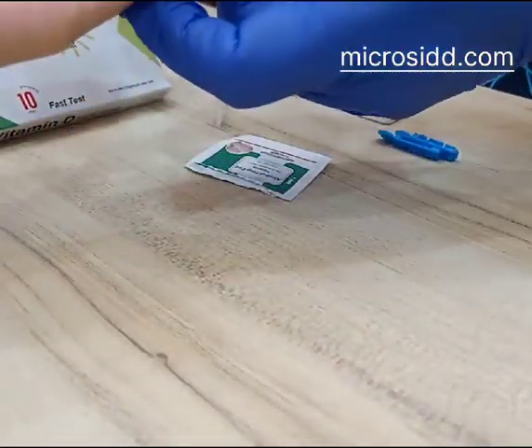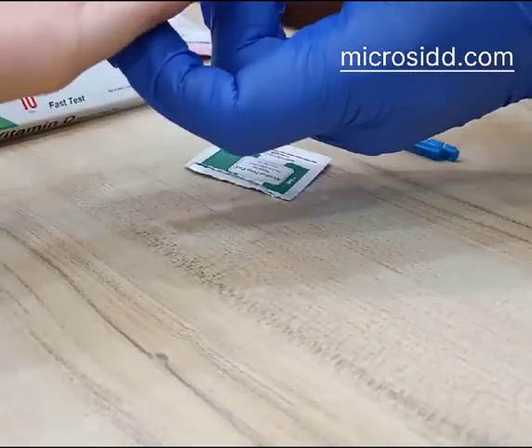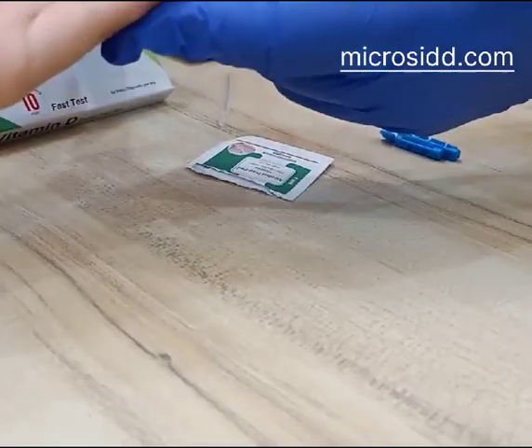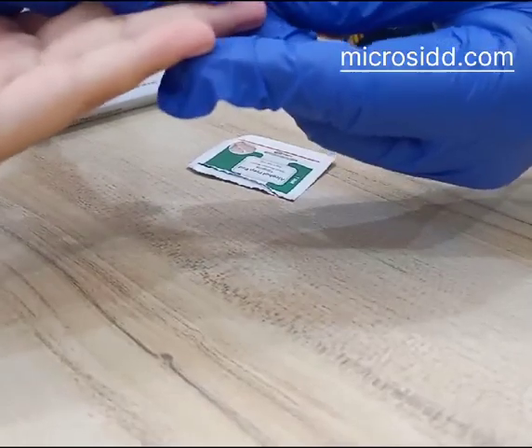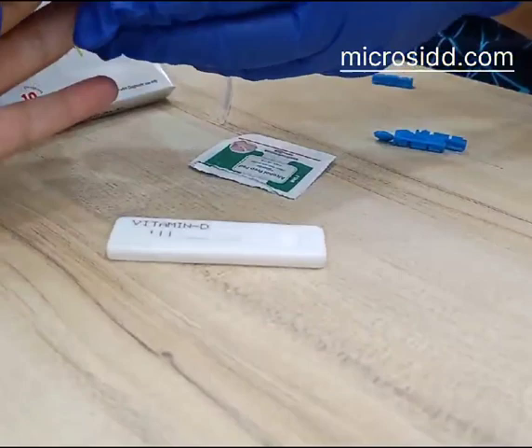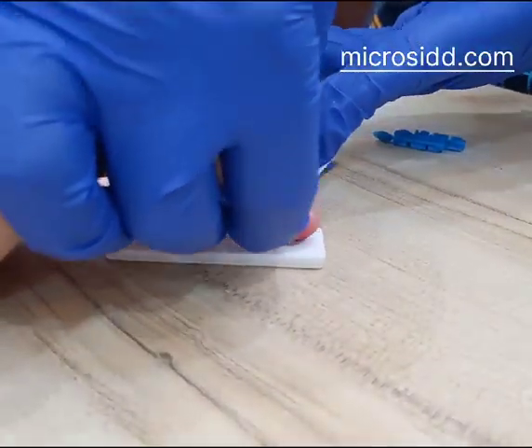Here is the patient sample — just one small prick. We require a drop of blood, directly put on the well.